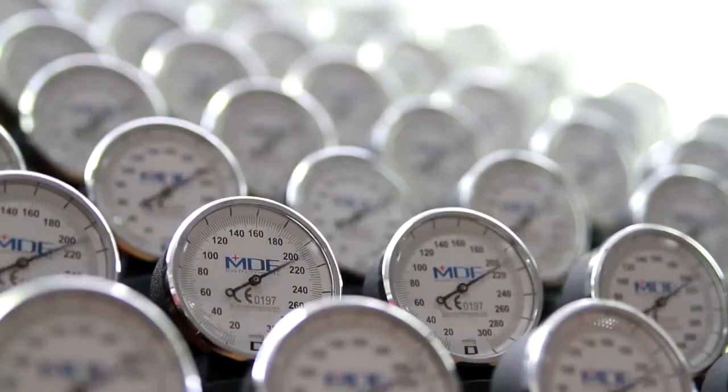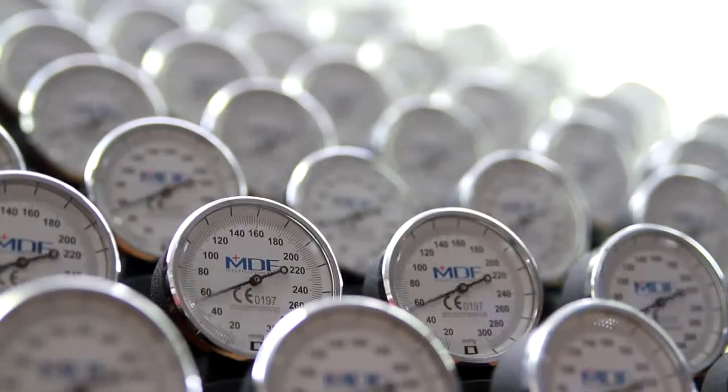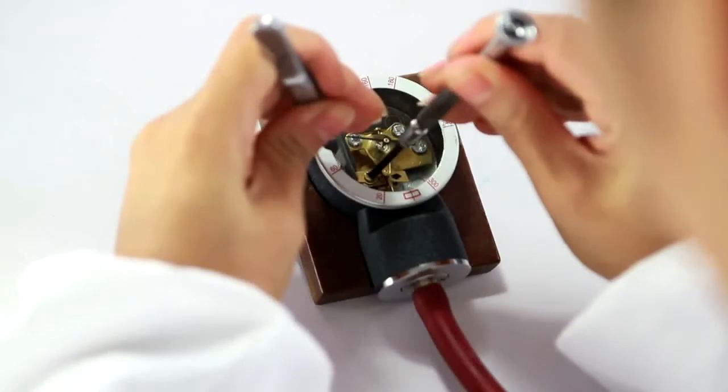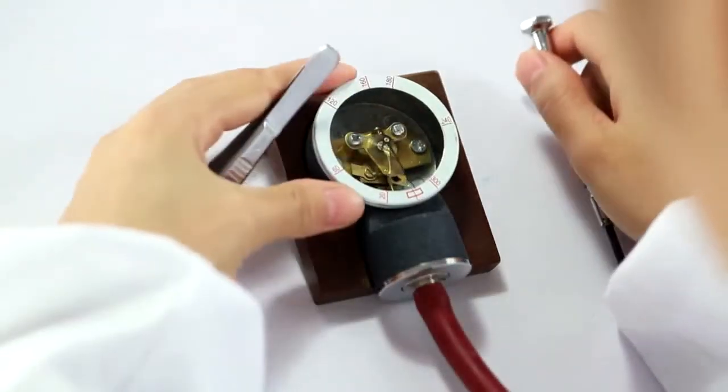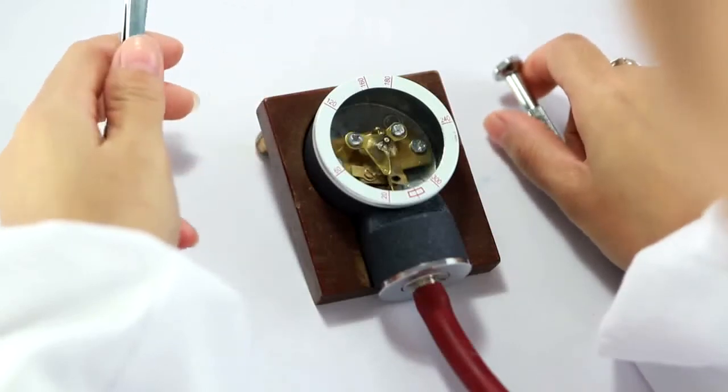That's why we stress test each one of our gauges 3,000 times before it even leaves our facility. That's each gauge, we're not spot checking. We also calibrate each gauge five times, and this is one of the things that really sets us apart from any other manufacturer out there.